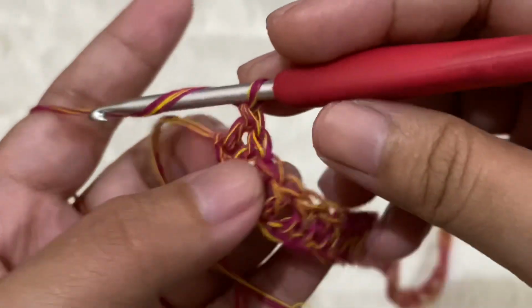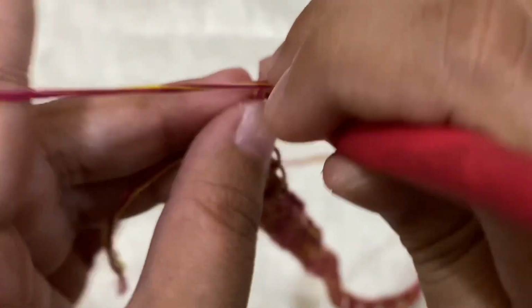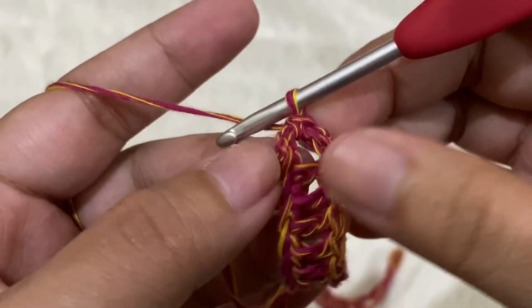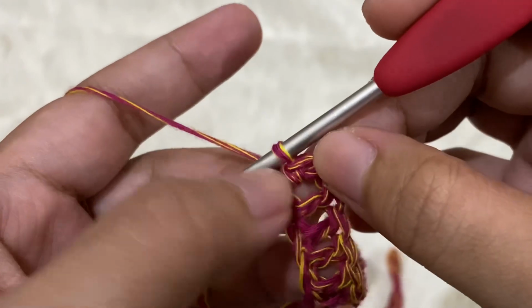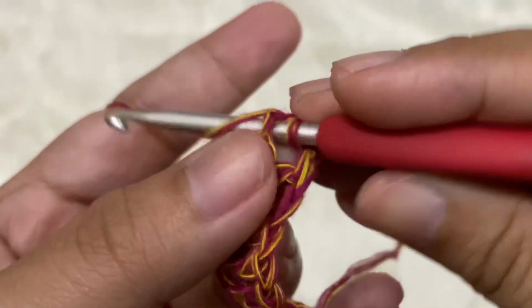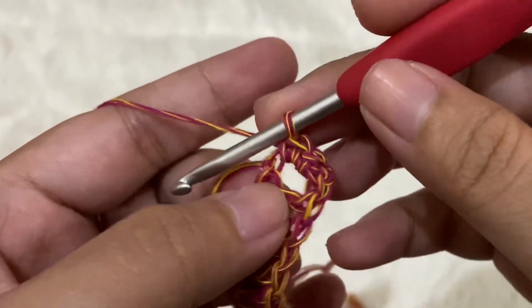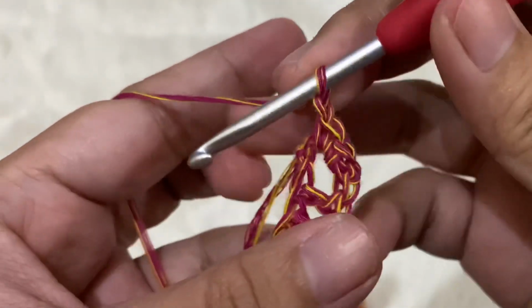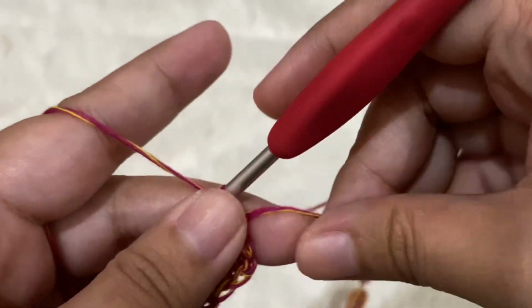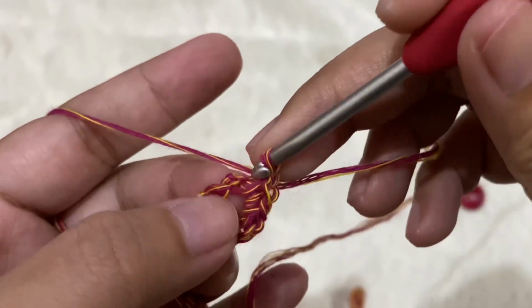So for round 3, just chain 1 and single crochet around that double crochet stitch, and another one, okay, around the double crochet stitch as well, and chain 1, okay, and single crochet on top of that double crochet.